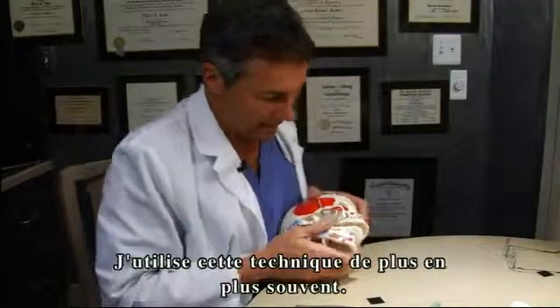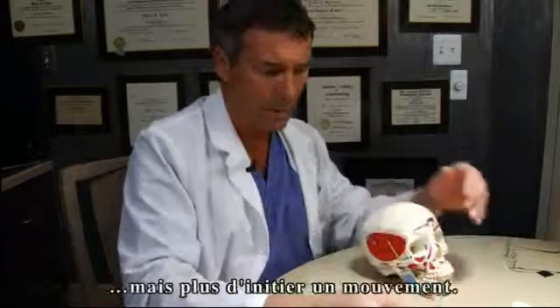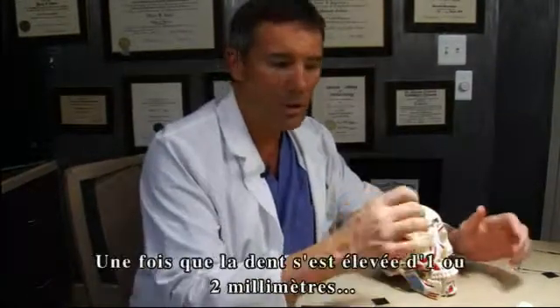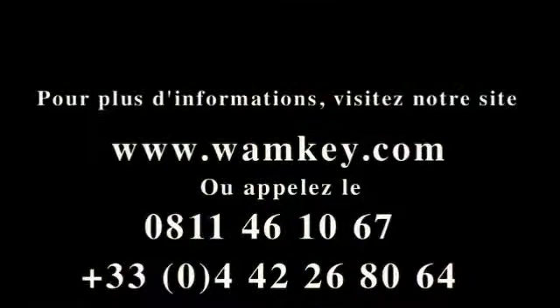The point of the forcep is not to deliver the tooth, but rather to provide initial movement. Once you get the tooth to move a millimeter or two, deliver it with a rangeur or a conventional forcep.